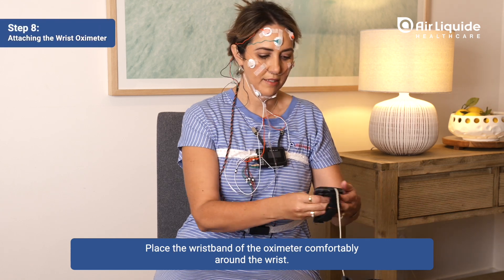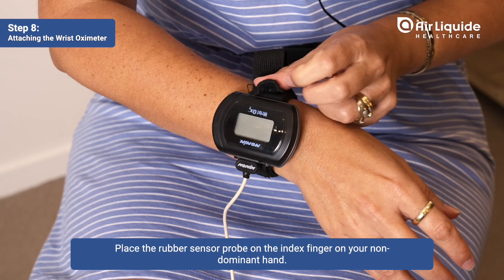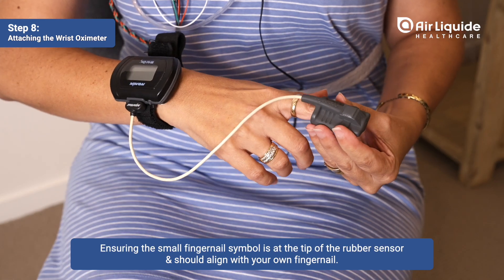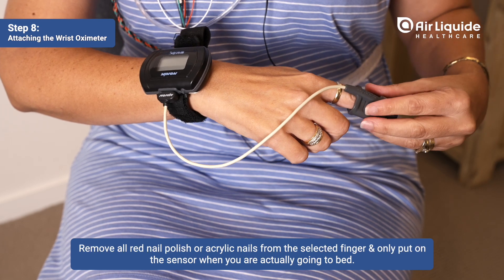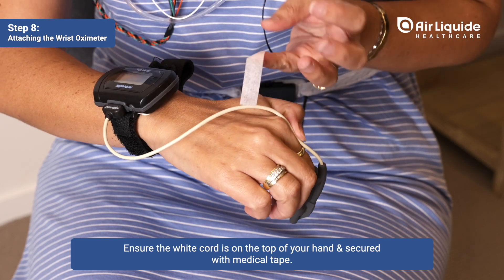Place the wristband of the oximeter comfortably around the wrist. Place the rubber sensor probe on the index finger of your non-dominant hand, ensuring the small fingernail symbol is at the tip of the rubber sensor and aligns with your own fingernail. Remove all red nail polish or acrylic nails from the selected finger, and only put on the sensor when you are actually going to bed. Ensure the white cord is on the top of your hand and secured with medical tape.